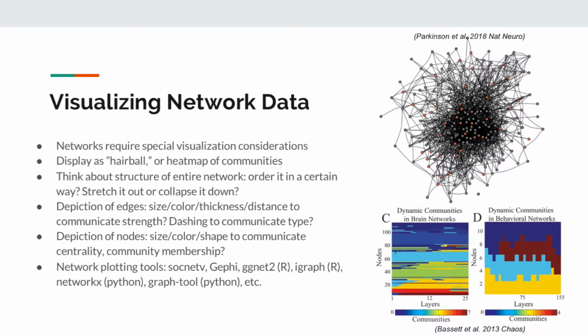And then there's visualizing network data. Networks require special visualization considerations. You'd want to display things either as a hairball, like above right, or kind of heat map of communities, how certain nodes in the network are clustering. You can show them visually like below.